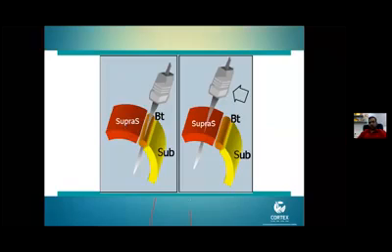For beginners in shoulder examination, the problem is to identify which is supraspinatus and which is subscapularis, because everything looks similar. So first we find the biceps tendon and keep the probe parallel to the biceps tendon. You can easily see the thick fibrillar structure of the biceps tendon, and from that you move lateral, posterolaterally.